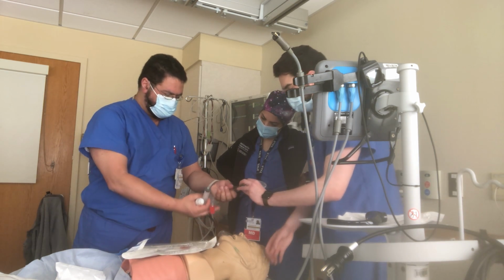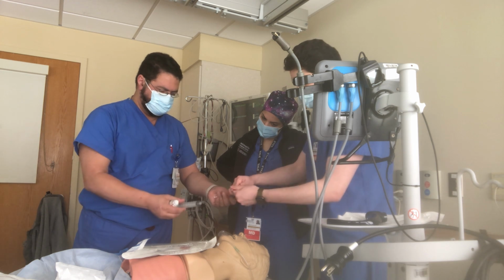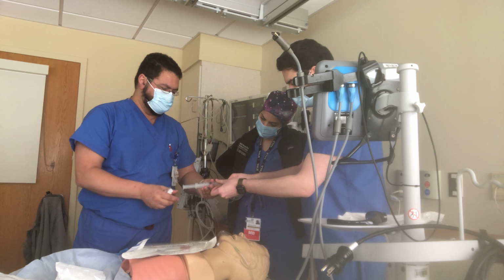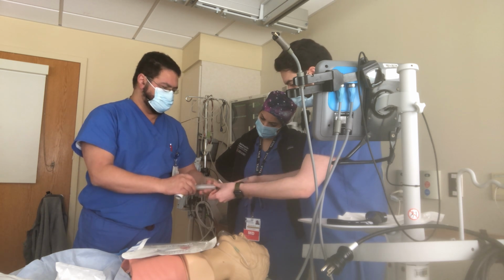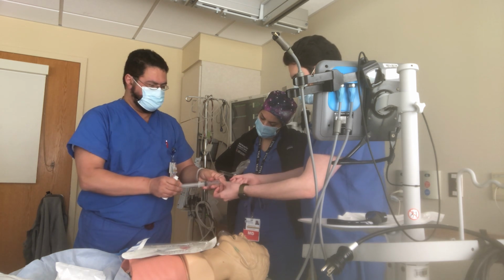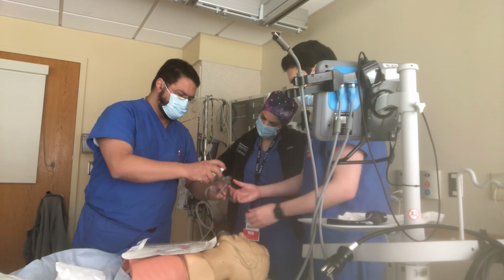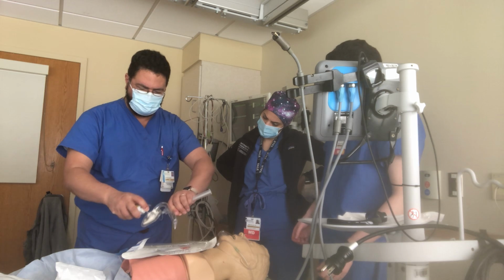All right, we're supposed to test the balloon. Remove this, and put 20 cc's. This is how it looks, right? Pull it back. Okay, now I'm gonna lubricate it with this. It's not the best lubricant, but I'm gonna lubricate with this.